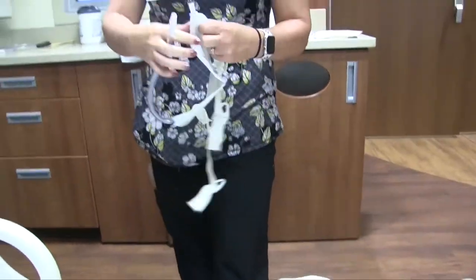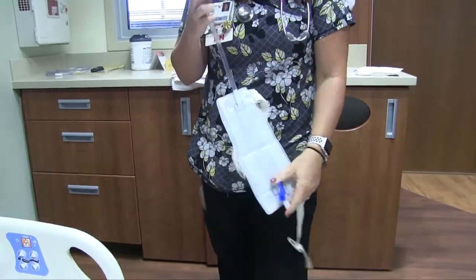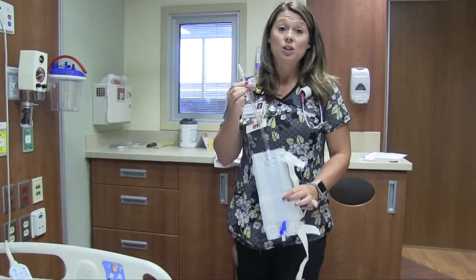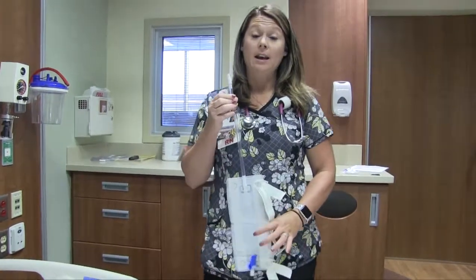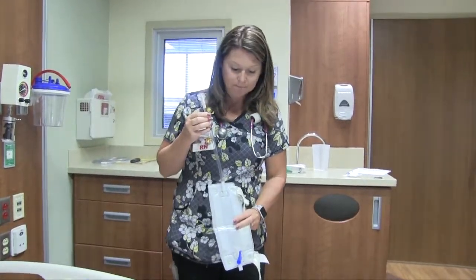Okay? So this system you're going to use when you're up moving around, you need to go to your doctor's appointments, you need to go to the grocery store. Keep in mind this bag is much smaller and holds a lot less urine than the large bag. So if you're going to be going on an outing, please plan on needing to empty this because you're going to need to, okay?